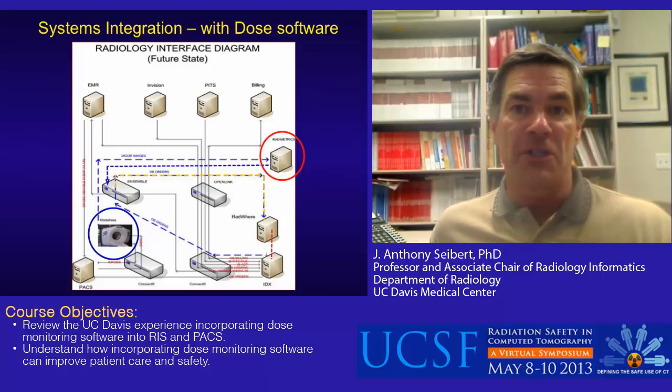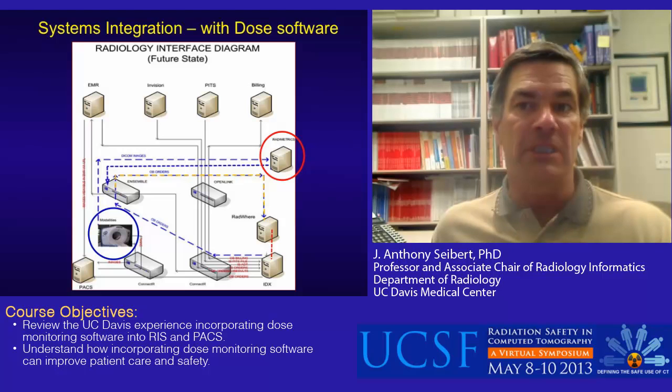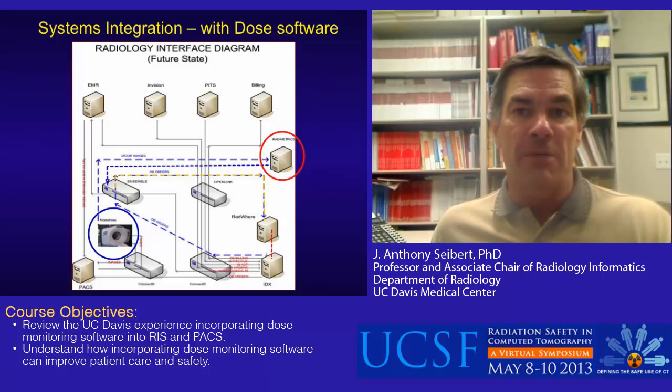The interface engine then, in turn, sends the data via HL7 to the speech recognition engine, blue-orange dashed line, incorporating the data into the CT dose template field in the dictation report. This interface engine also orchestrates data flow for many other devices in the enterprise. Dose metric information becomes part of the completed interpretive report sent to the RIS from the speech recognition software, red dashed line, shown in the lower right area.